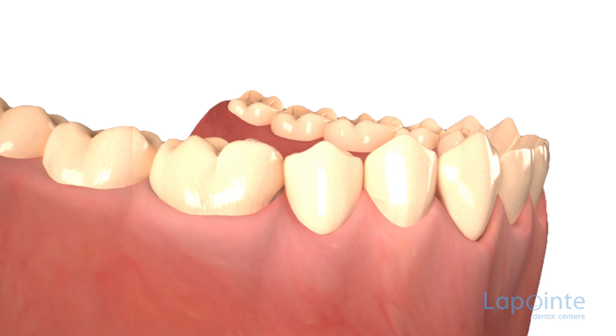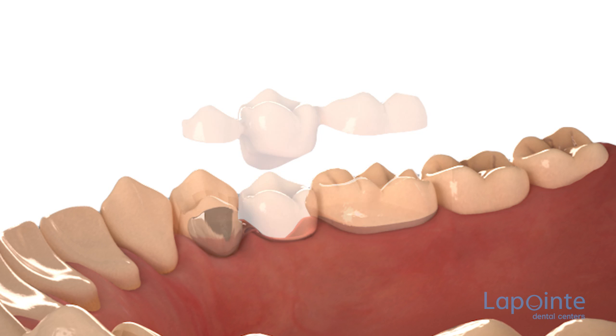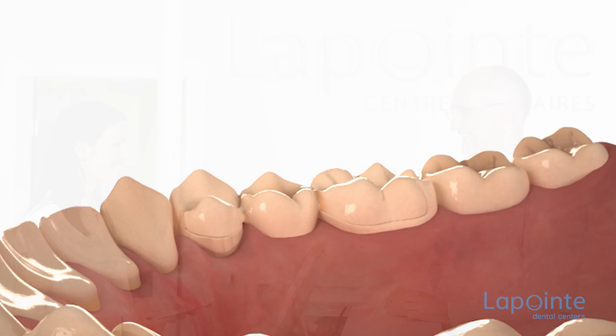The fixed bridge is less conservative but more durable than the butterfly bridge. We can also use a wing on one side and a crown on the other — this type is called a hybrid. The California bridge, which uses inlays instead of a crown, is much more conservative.